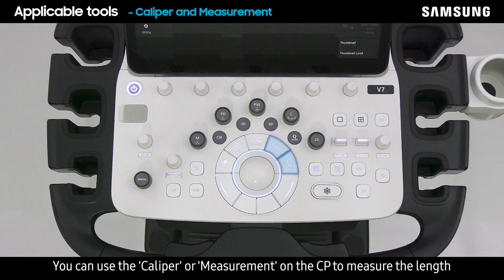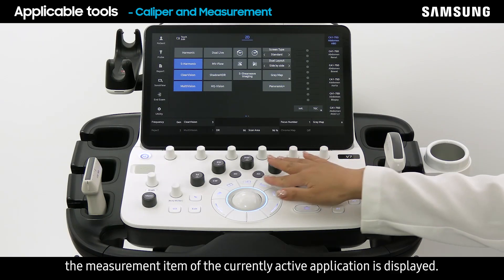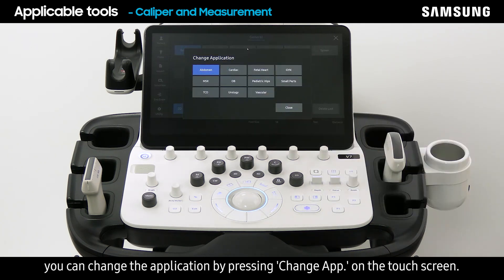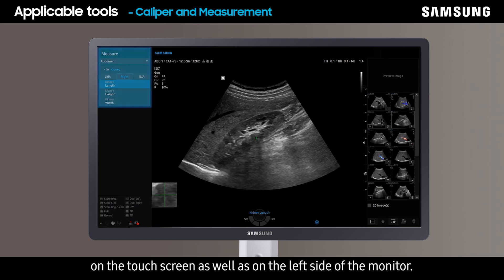You can use the caliper or measurement on the control panel to measure the length and volume of structures, as well as the speed of blood flow. When you press measure, the measurement item of the currently active application is displayed. If you need more items, you can change the application by pressing change app on the touch screen. Items for measurement and caliper are displayed on the touch screen as well as on the left side of the monitor.